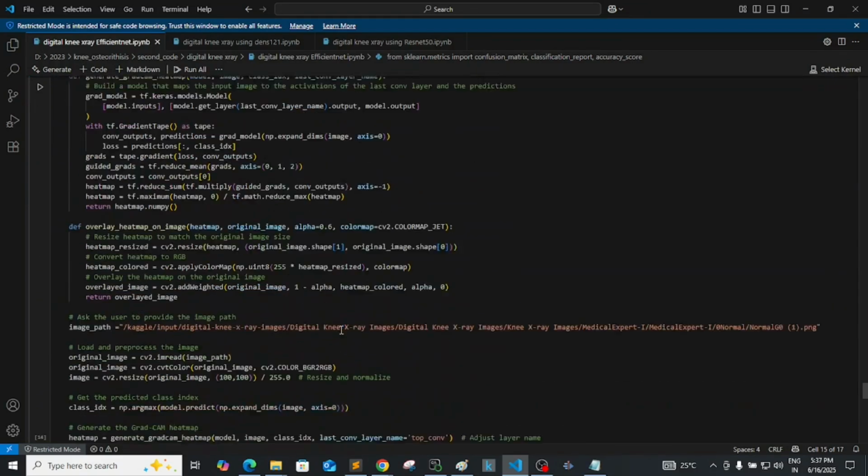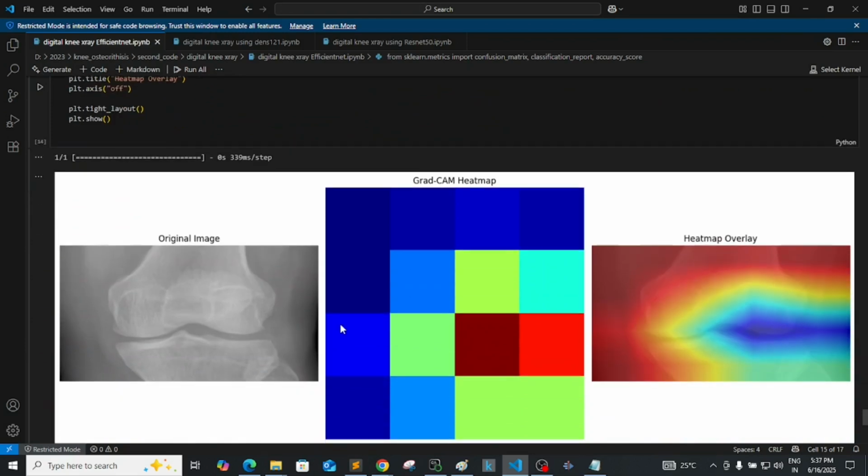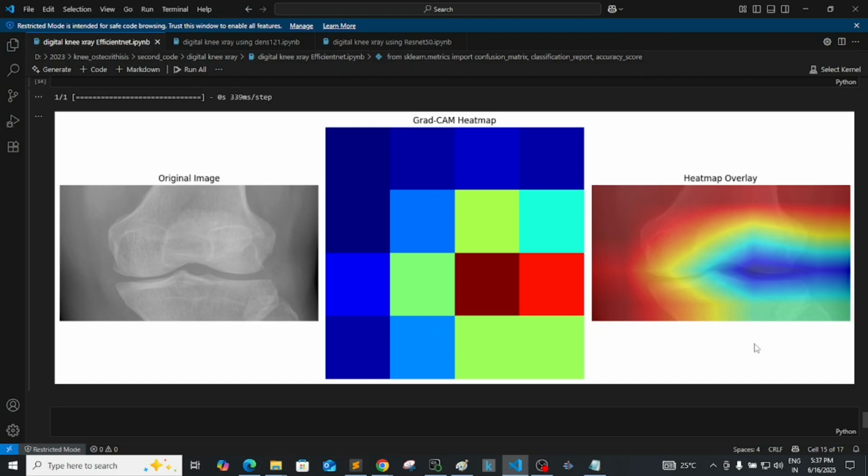And then we apply explainable AI, as I mentioned. The first paper even tried to discuss this. In our case, you see the bluish color. Explainable AI is a technique that highlights the region of impact, the region that impacted the classification a lot. It doesn't mean the remaining area is waste. It means that the particular area is more impactful than the remaining area for the classification. This is a way of analysis.